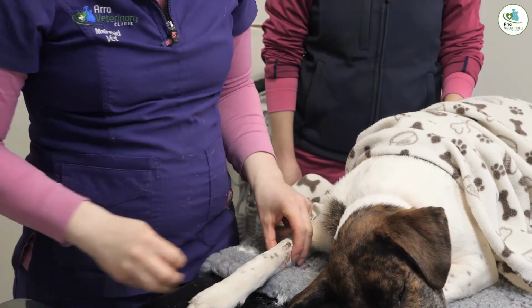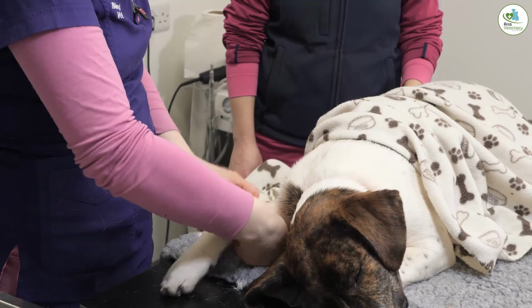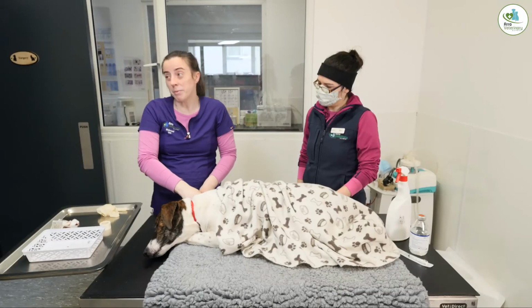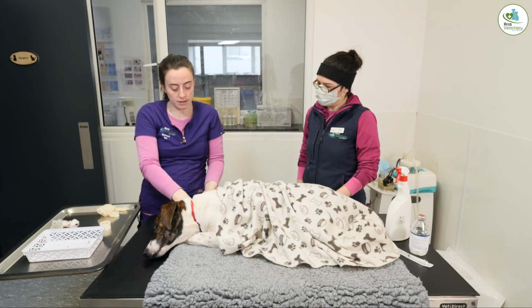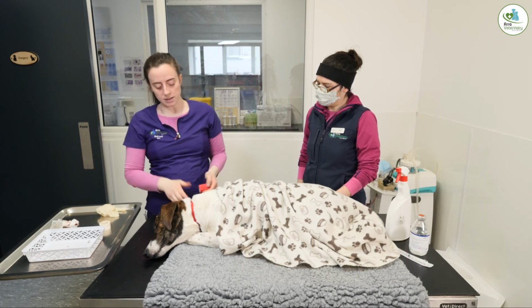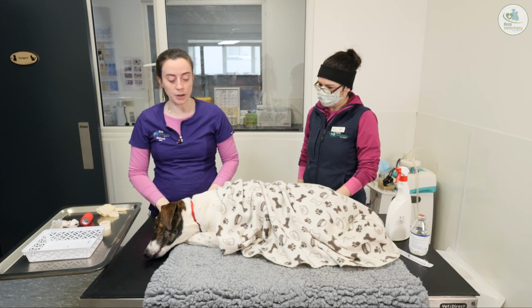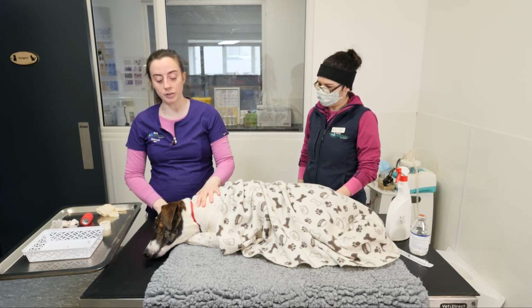So that's it secured now. You can apply more tape then just to keep it in place. Pro wrap, vet wrap, any of those kind of ones that will stick down on themselves. So that's it in place there, and we've just covered it up now so that nothing will happen while we prepare Covey for surgery.